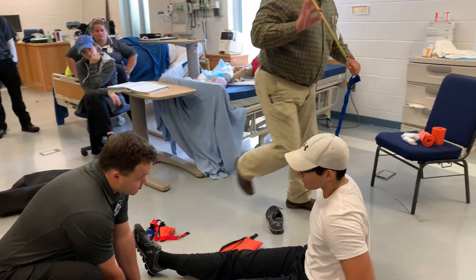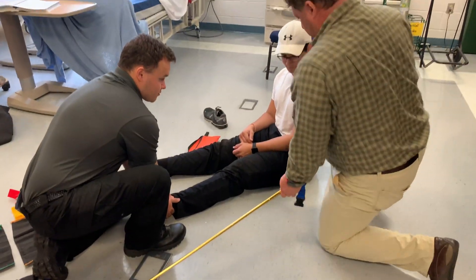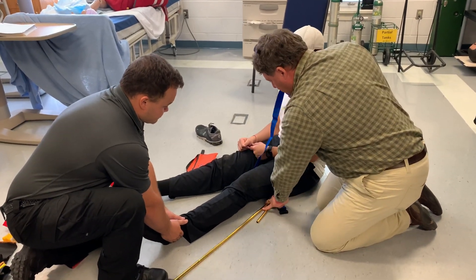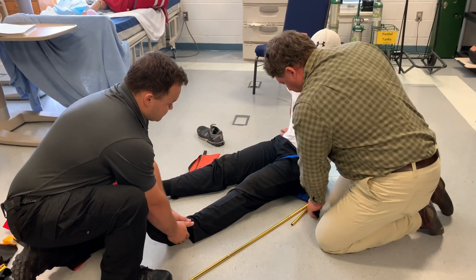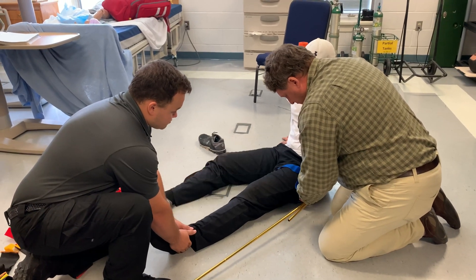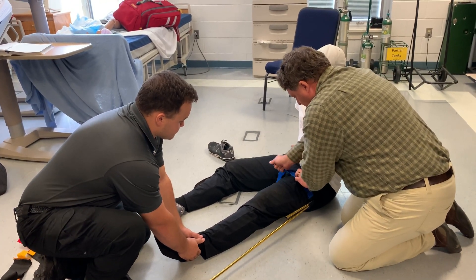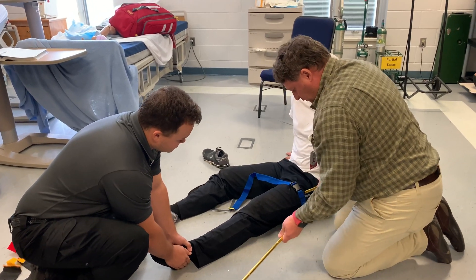Come around to the injured leg, and to do this I usually just seesaw it, slide it up like that so I don't have to be reaching in there. Get that fairly secure — I may have made that too long, but that's okay, I'm going to adjust it if I need to.